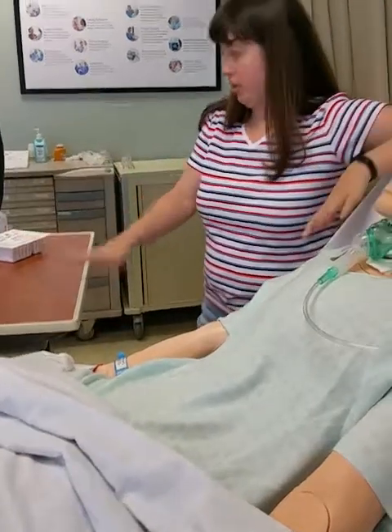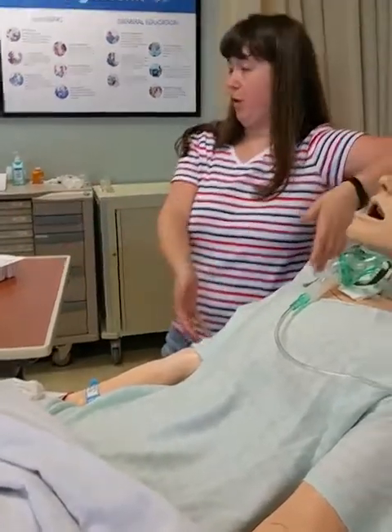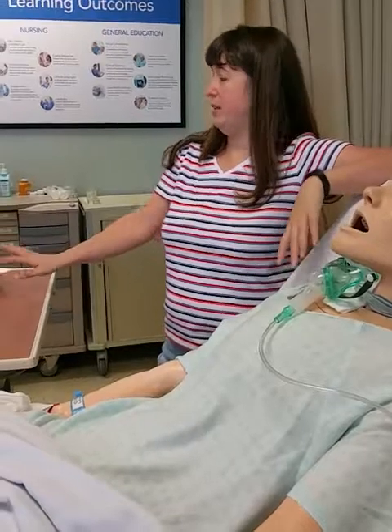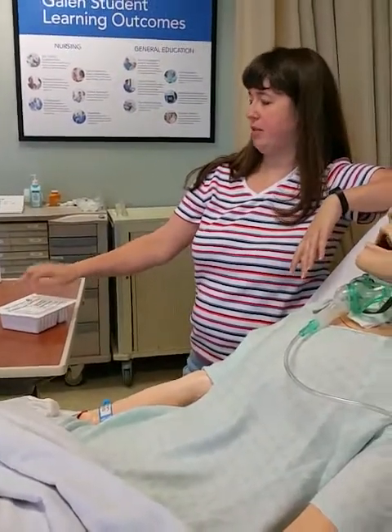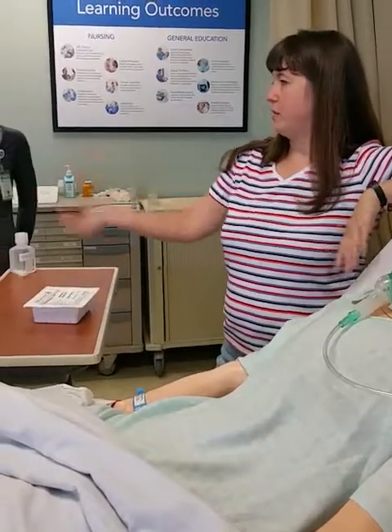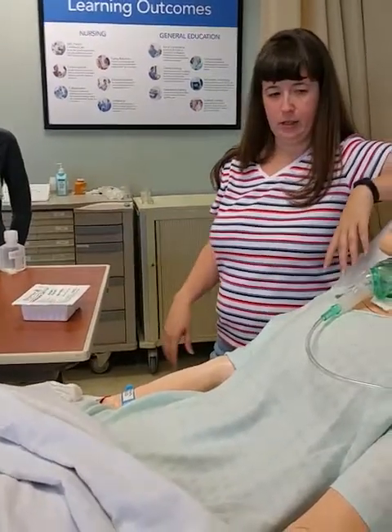Care. You would do that suction, you would clean up your suction mess, and then you would go and do your trach care. Some facilities, it's all in the same kit. Like the ones you guys have in your bags probably have the suction catheter in here so that you can suction and clean all at the same time.